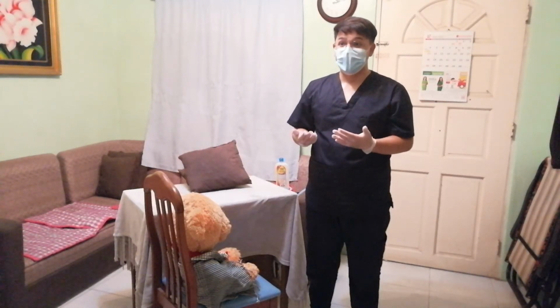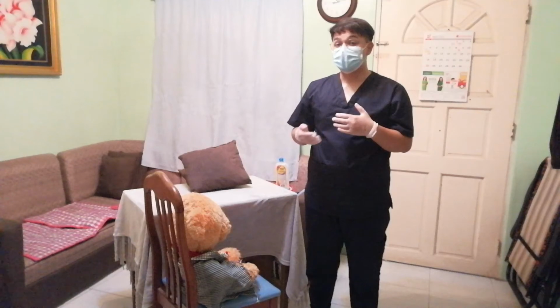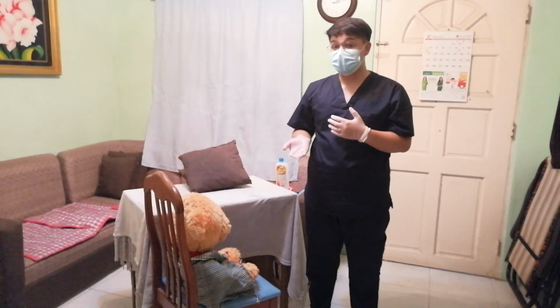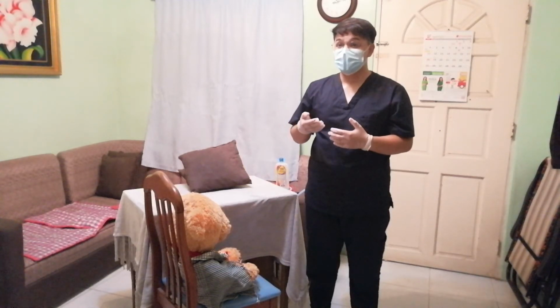Now we will proceed to our 18th step. We need to assess the patient's alignment to the chair, and also we need to remove the gait belt on the patient's waist if desired.